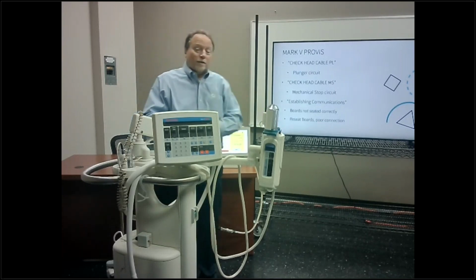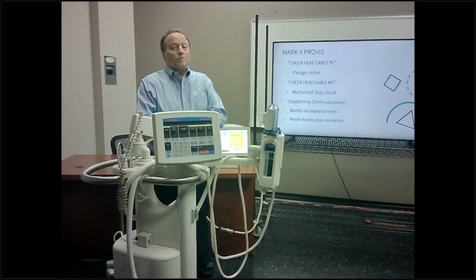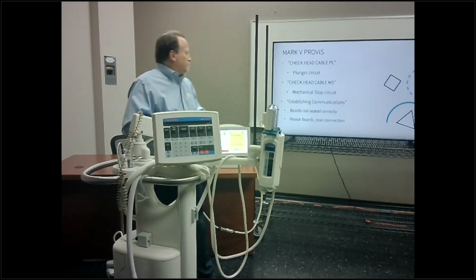Boards not reseated correctly. They could have been in the wrong spot. Like I said, if you're just doing a PM on it, you pull a board out to inspect it, they can go in the incorrect spot. Luckily, that cabinet is labeled on each side on where the boards go.